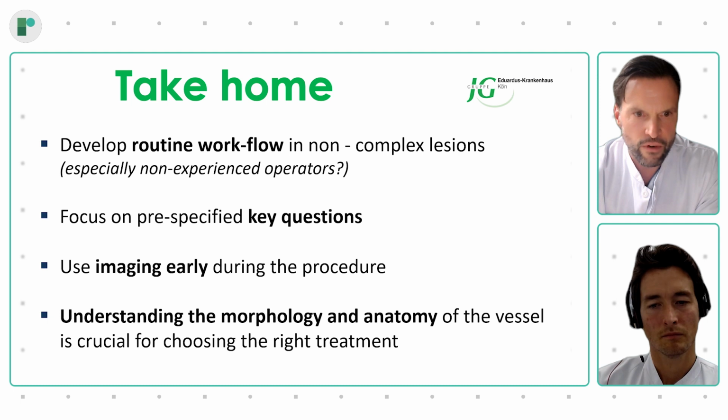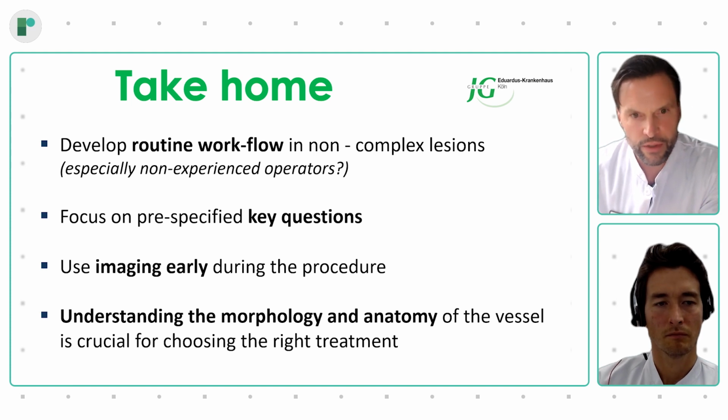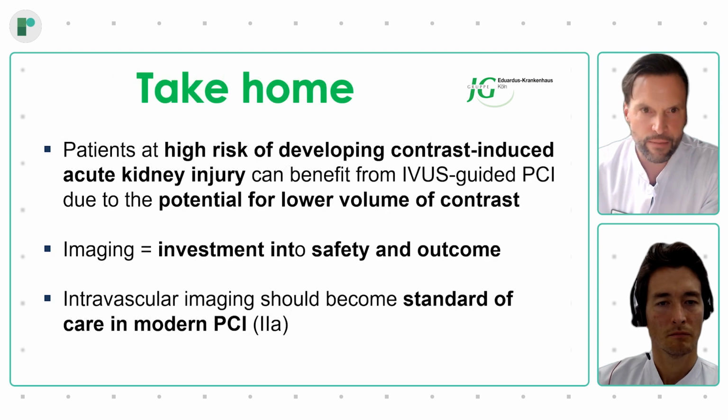And I think it's very helpful to understand the morphology, the pathology, and the anatomy of the vessels to choose then your treatment plan and your strategy, not only to help you decide the diameter of your stents, but even how long it should be, where you want to place it, how you want to place it, if there's a significant need for lesion preparation, and so on. I think we showed some very helpful examples.